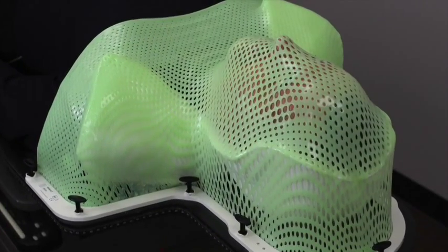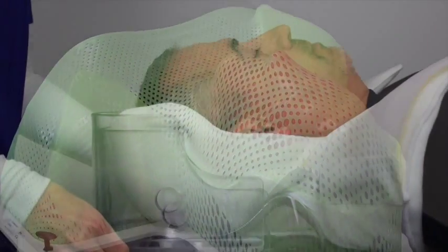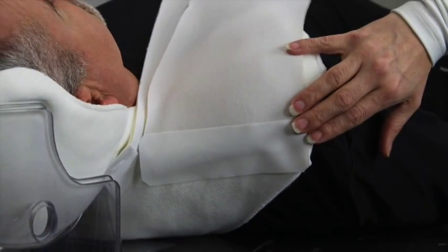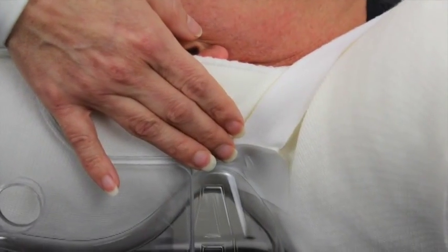The Clarity shell system creates a fully encompassing head support system with the highest level of stability while offering a warm and soothing experience for your patient.